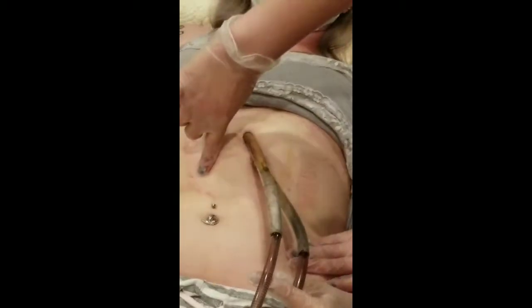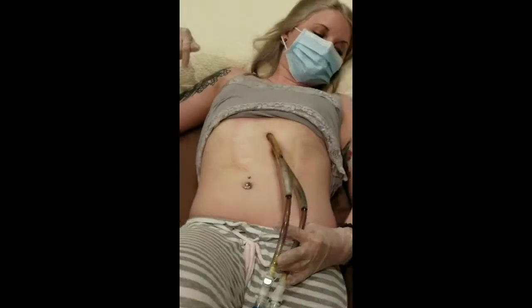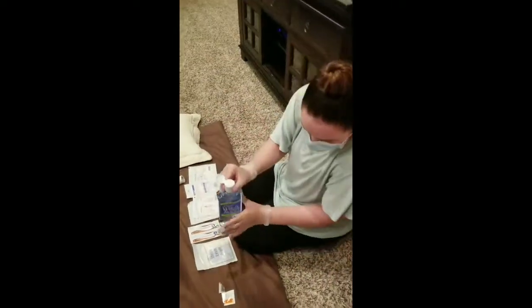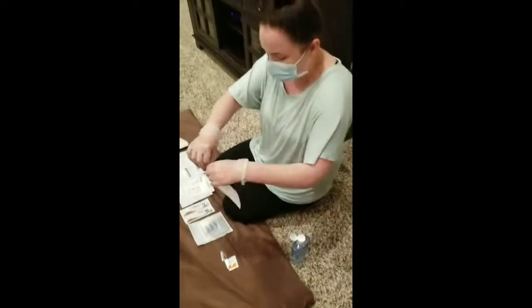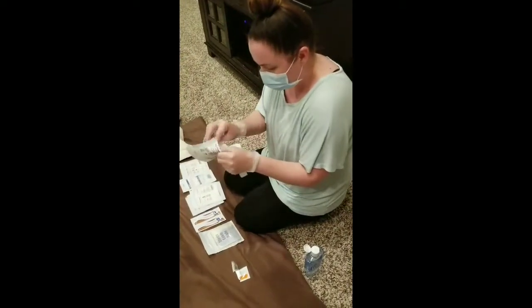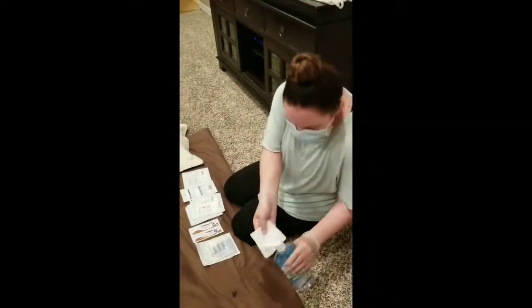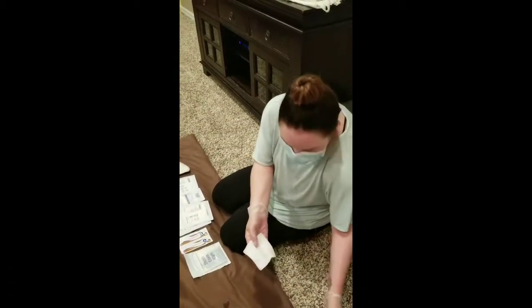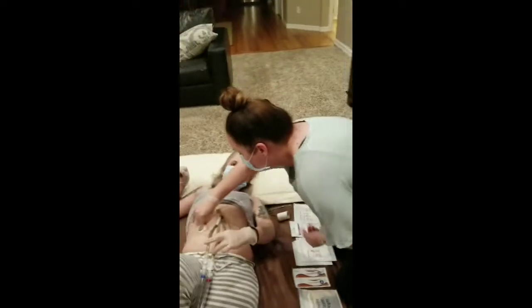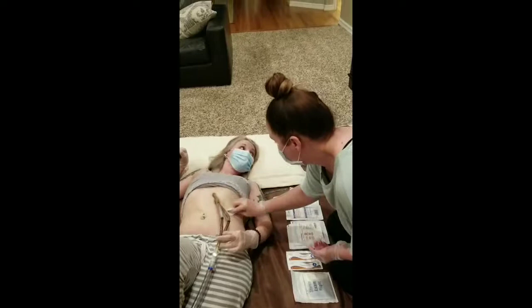As you can see, she has a little scab right there, and that's pretty normal from the tape. So the next step, we're going to take our witch hazel. At this point, we're not sterile, so I can touch all this. We really just use the witch hazel to soothe her skin and just slightly rub around the area.